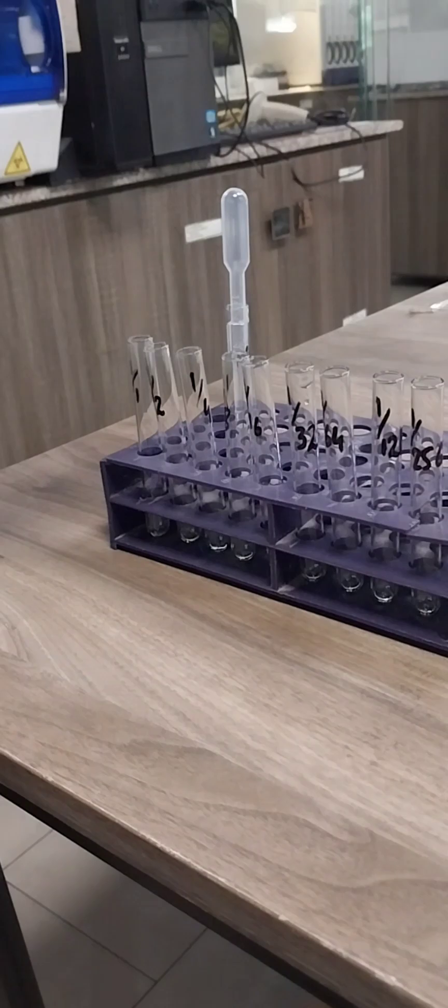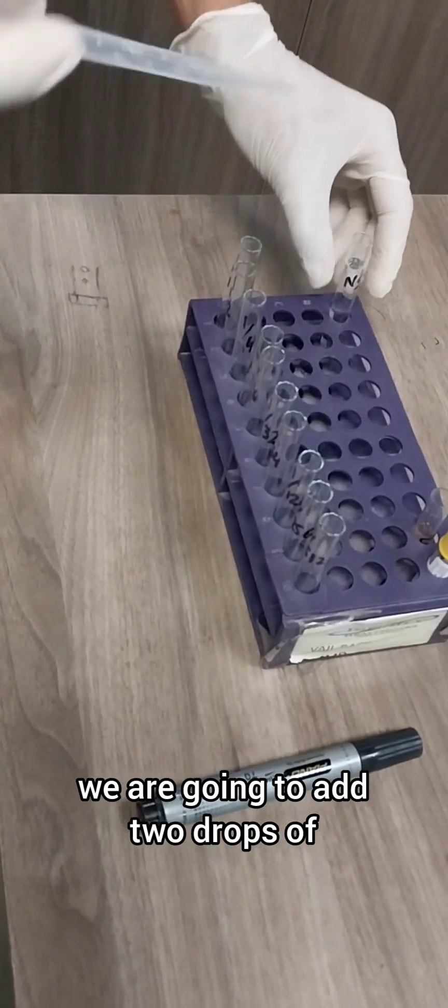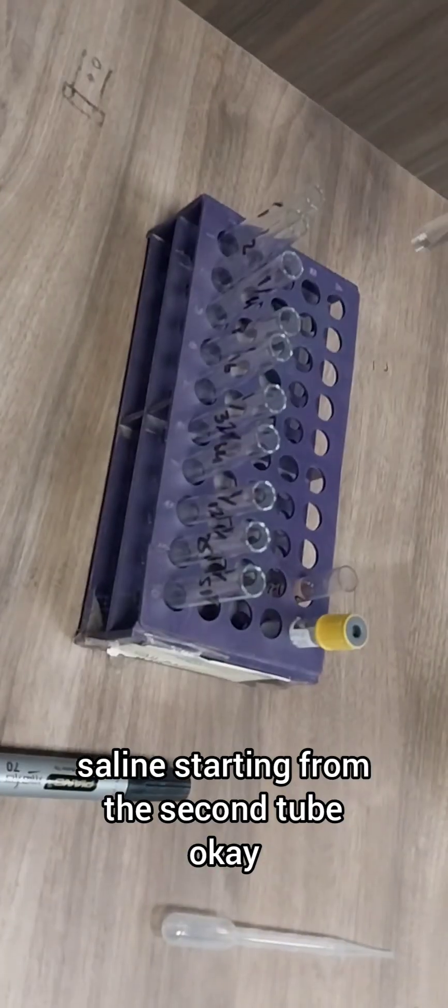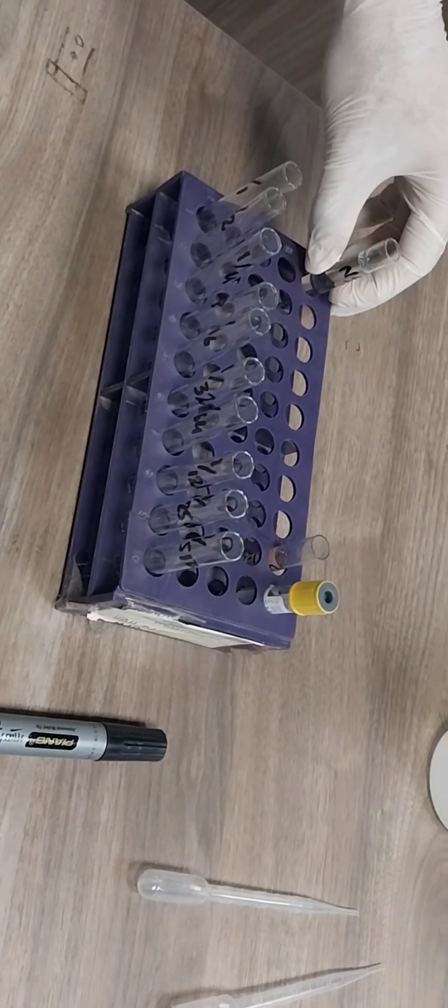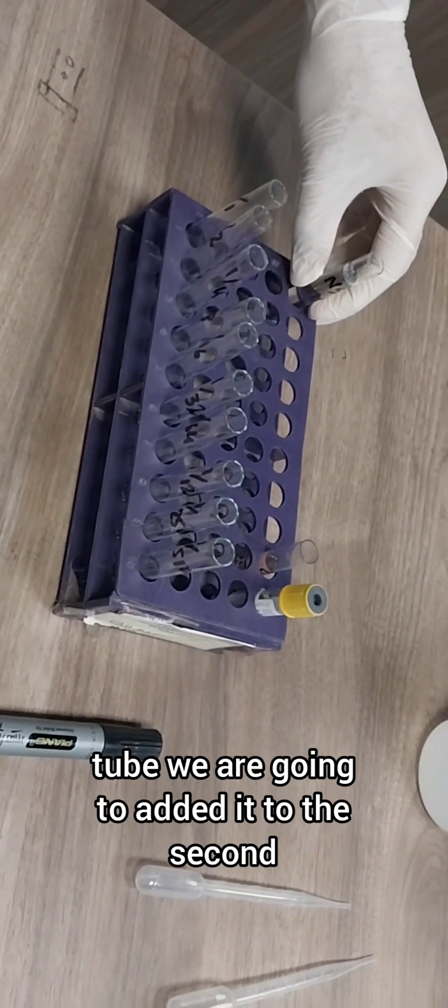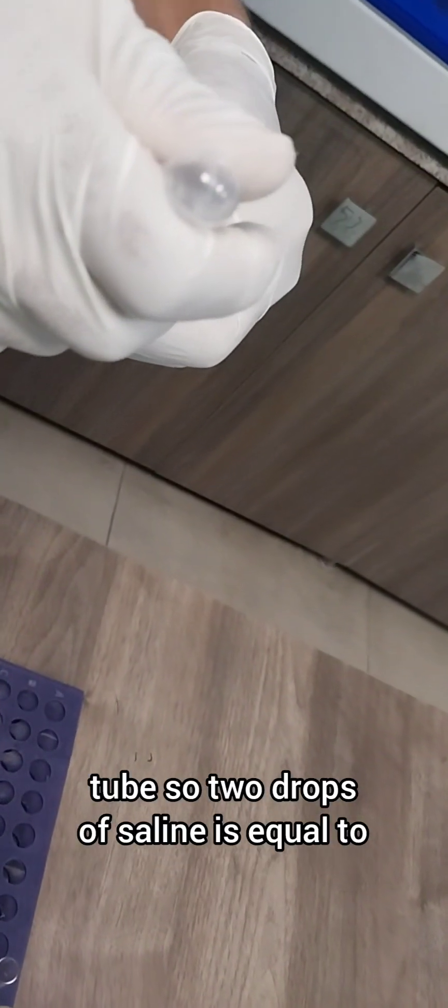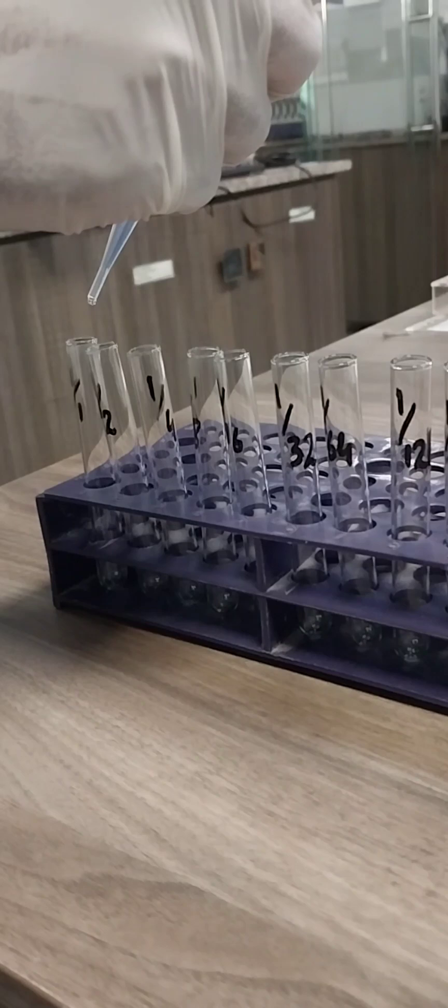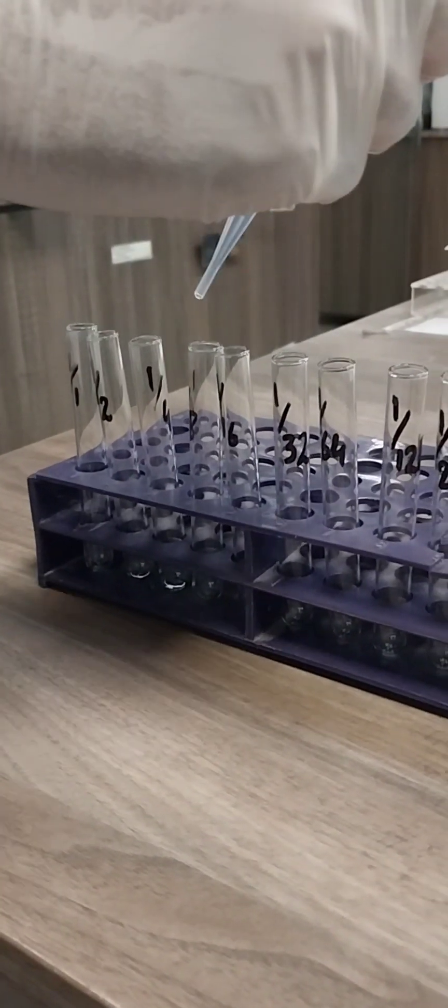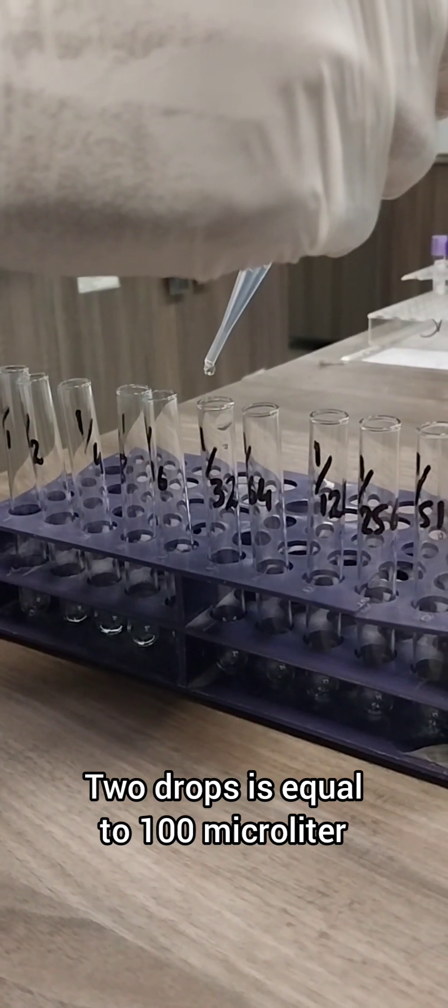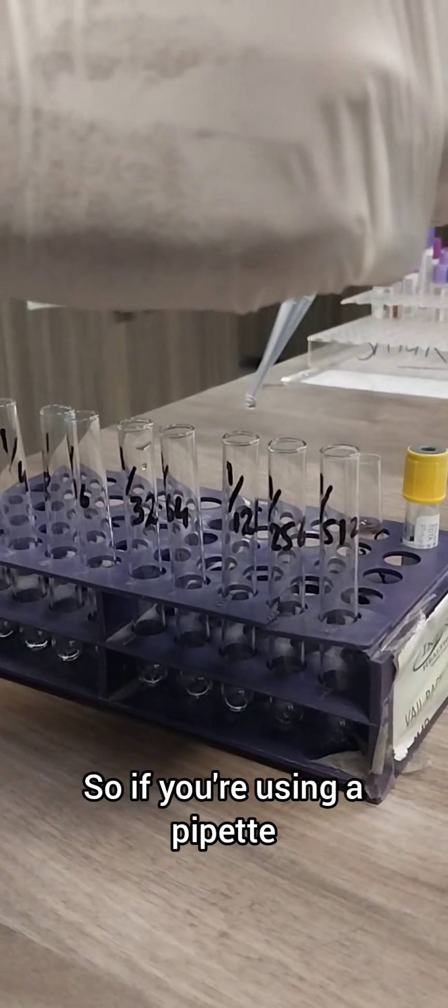The first step is adding normal saline to all of the tubes. We are going to add two drops of saline starting from the second tube. We are not going to add saline to the first tube. Two drops of saline is equal to a hundred microliters of normal saline.